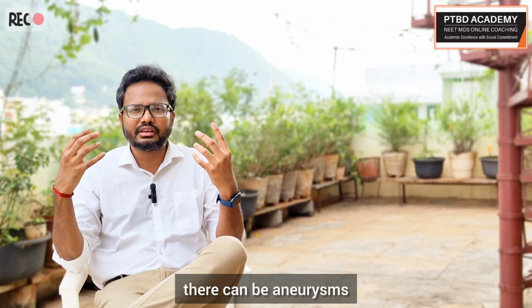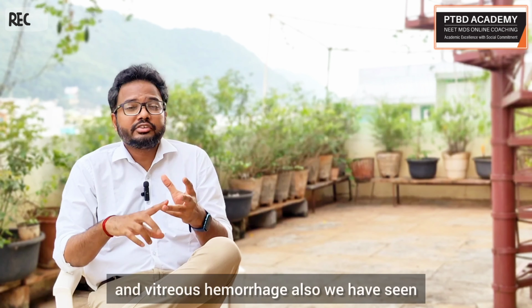We have seen what CSMO is all about and how there can be loss of visual acuity, even sudden loss of vision, along with some risk factors, management, and in the process, we even discussed Rubeosis Iridis, which can lead to glaucoma, right? And finally, we have seen some illustrations and tried to highlight the changes which we discussed previously, like microaneurysms, hemorrhages, hard exudates, edema, and vitreous hemorrhage also we've seen in the last illustration, and so forth, right?